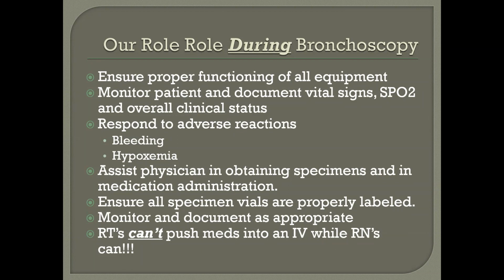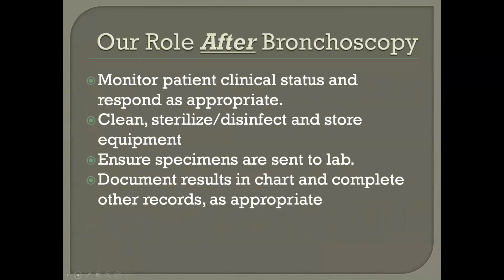Assist the physician in obtaining specimens and medication administration. Ensure specimen vials are all properly labeled. Monitor and document as appropriate. RTs can't push meds, as we said earlier on, but RNs and physicians can.